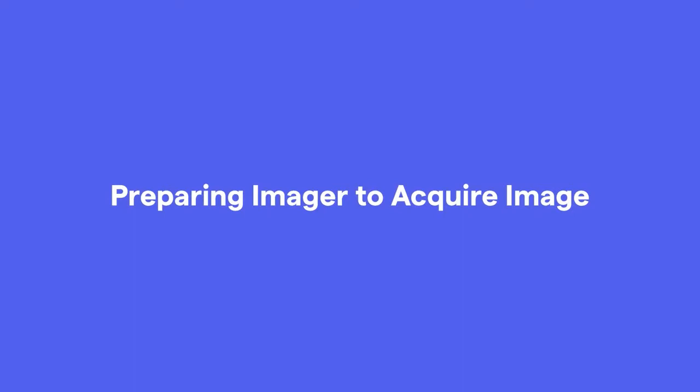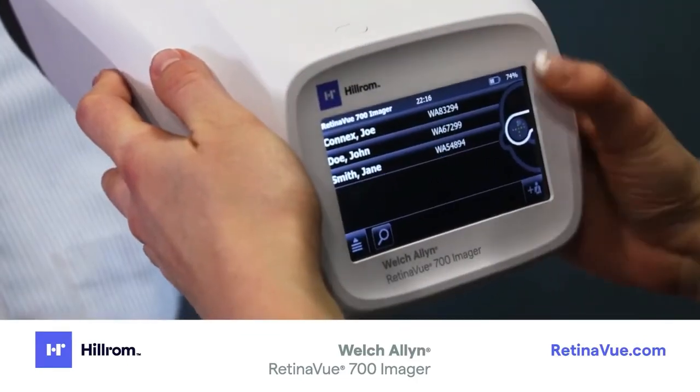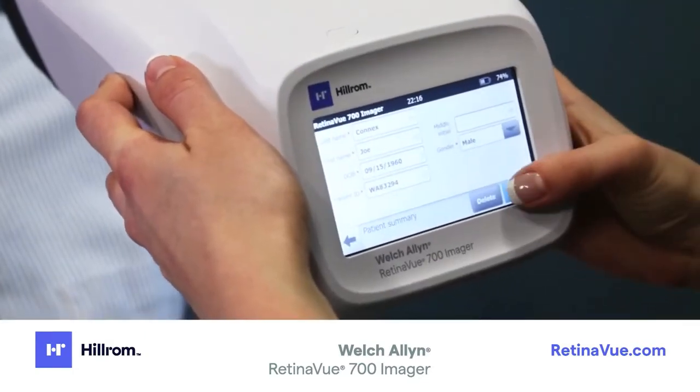Preparing the imager to acquire an image. Turn the imager on. After boot up, you will be presented with the patient list screen. Select your patient, confirm the patient information, and touch Exam.